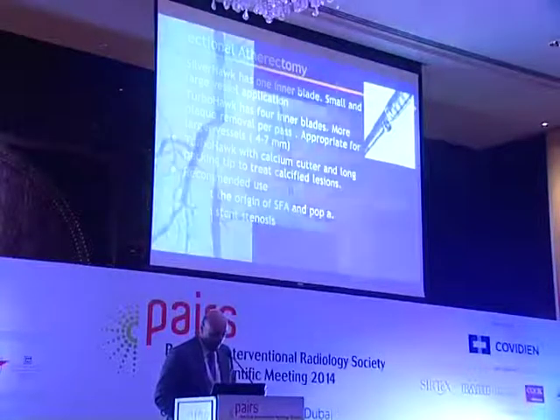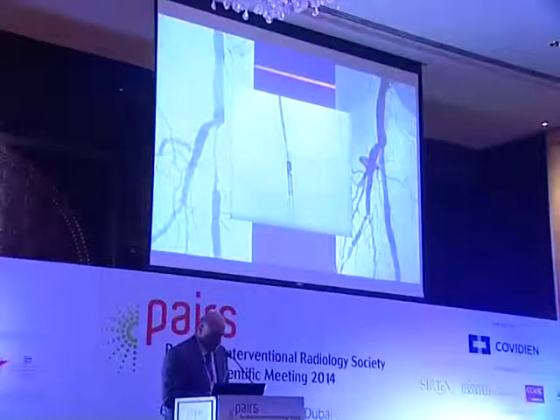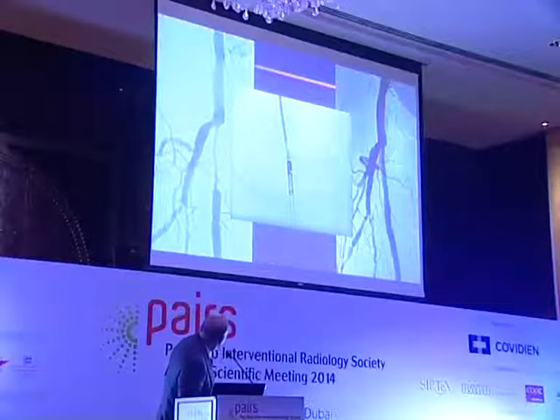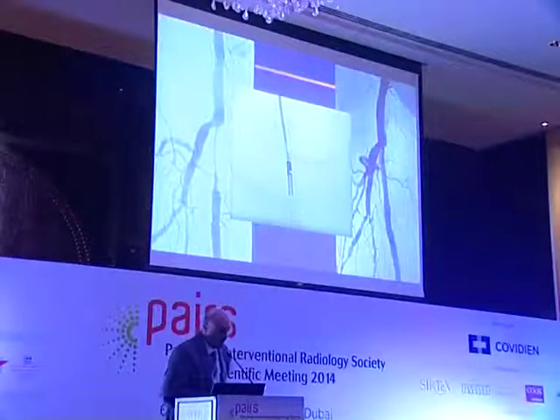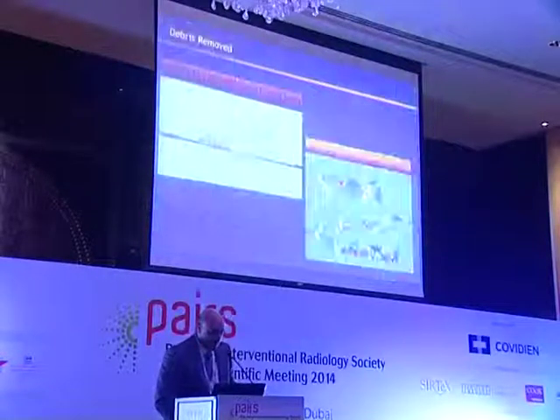And this is the device. This is one of these examples where you see the SFA origin disease, and this is the device, and this is after just using the device without any ballooning. So it can be a standalone.